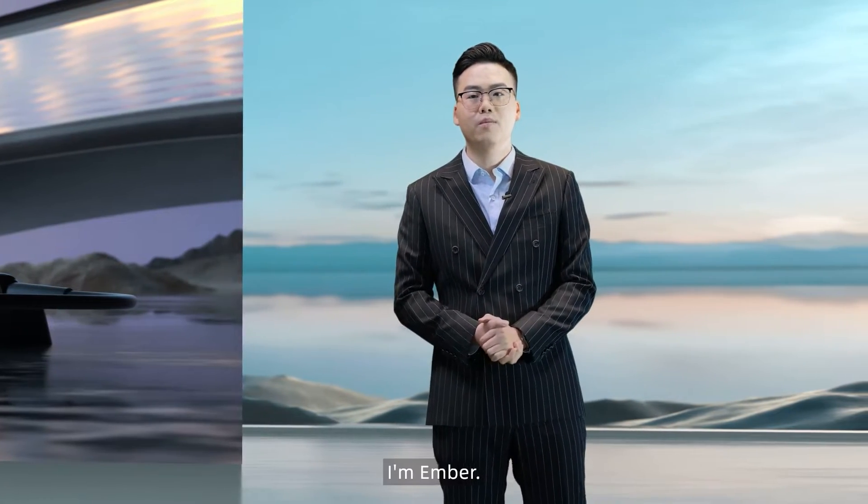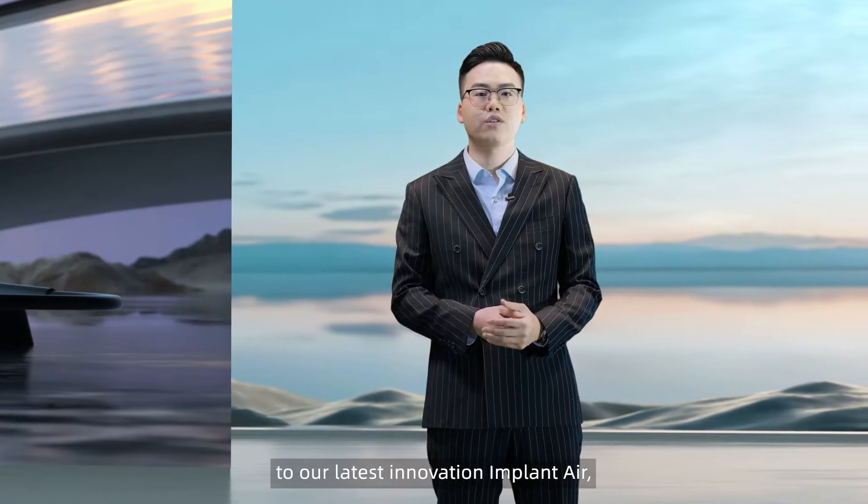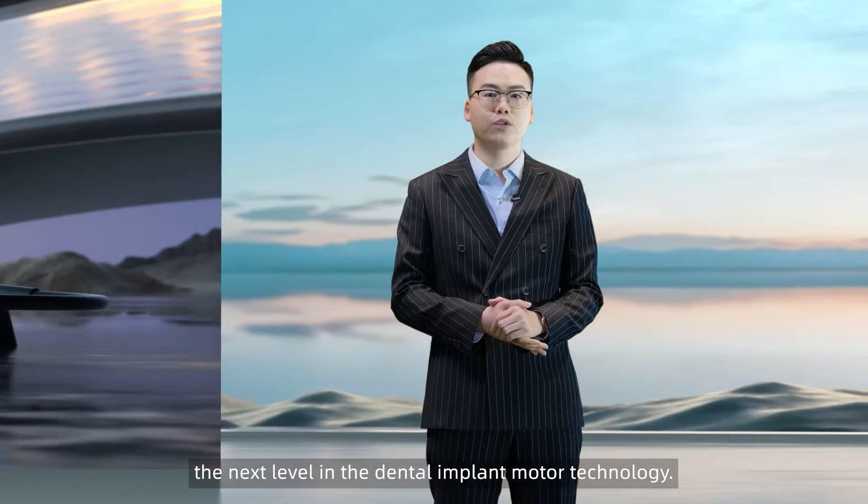Hello everyone, I'm Amber. I'm excited to introduce you to our latest innovation, ImplantAir, the next level in dental implant motor technology.